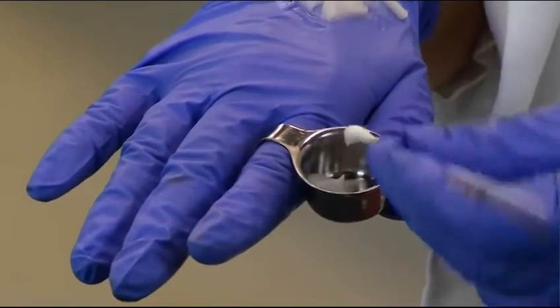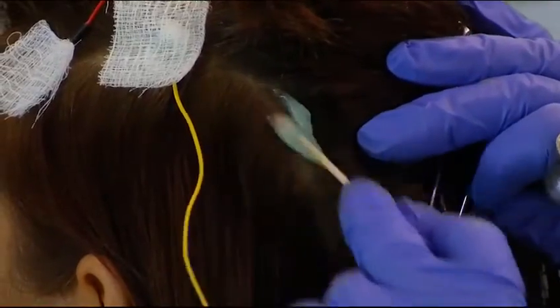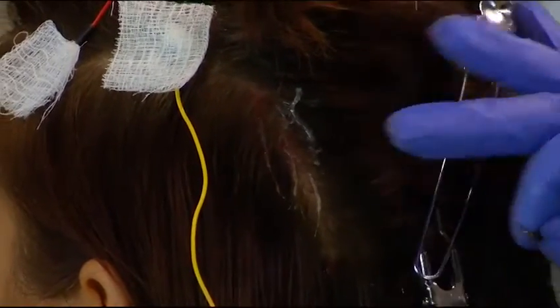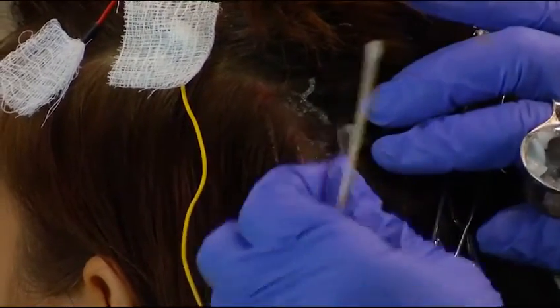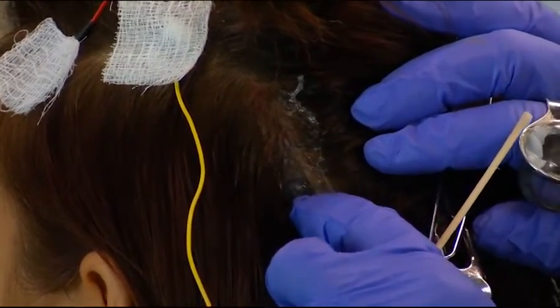Use just enough Nu Prep to moisten and color the cotton swab. If you use too much Nu Prep and try to rub it in, it makes the area where you're trying to put the electrode slick and the electrode won't stay in place. When you push, the electrode slides and changes the position of the electrode.